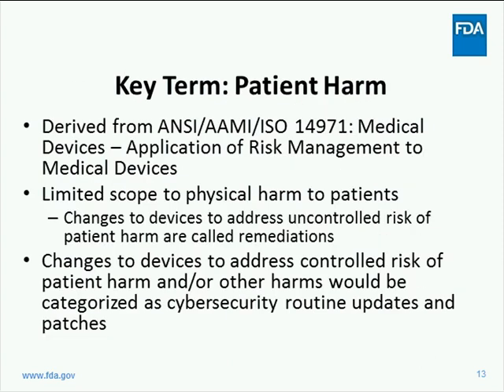Another key term in the final guidance is patient harm. The intent of the introduction of patient harm is twofold. One, to align with existing FDA and FDA-recognized standard definitions, and two, to appropriately scope vulnerabilities with the potential to affect safety and essential performance to those that could impact patients only.